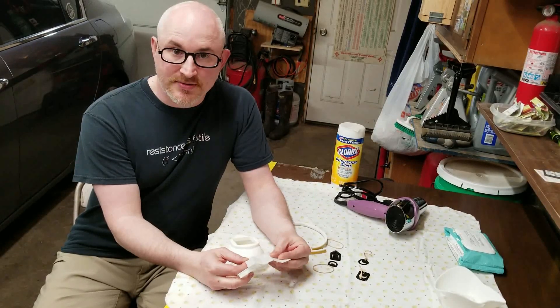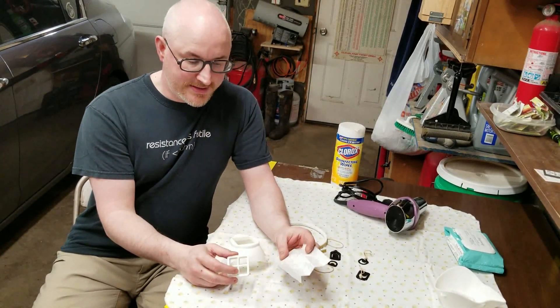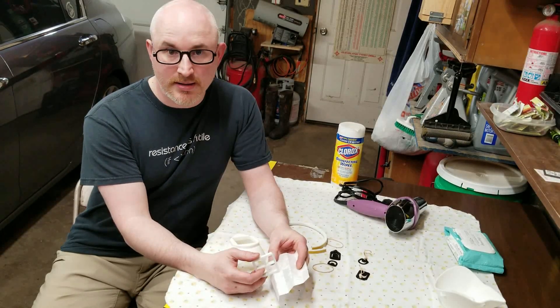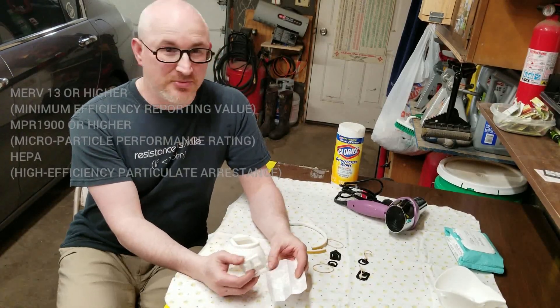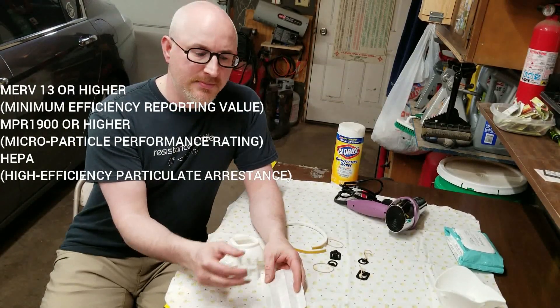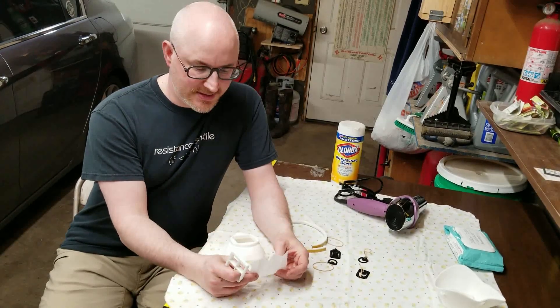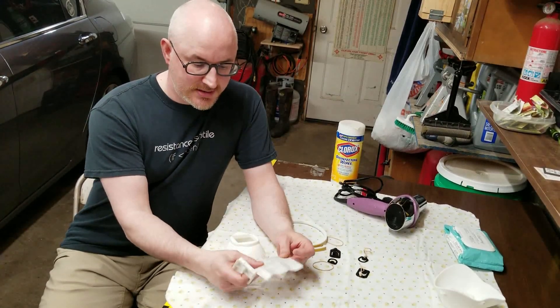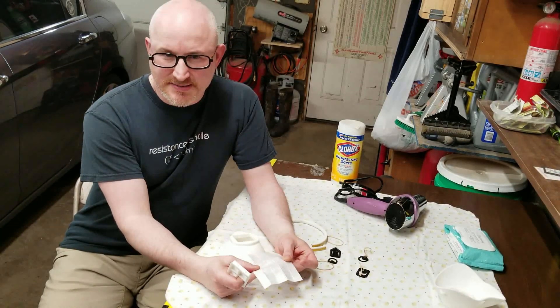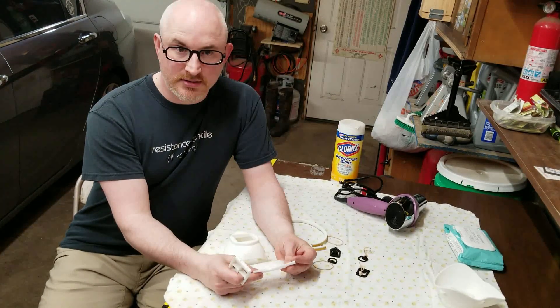You take a filter media — whether it's an N95 that's been cut into four squares, or whether it's HEPA or MPR 1900, 2200, or 2800. Basically that's the minimum particulate size that can get through the material. This will stop viruses, bacteria, etc. So what you do is cut that into approximately two-and-a-half-inch squares based on your window, or you can double it up if you want a little more protection.